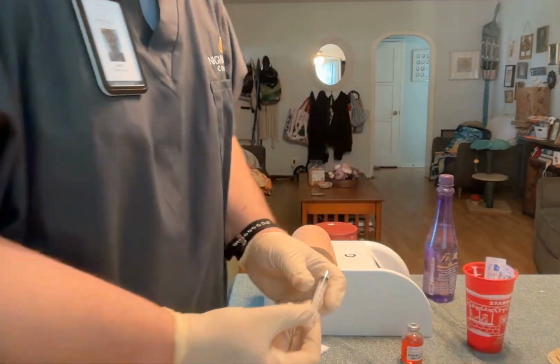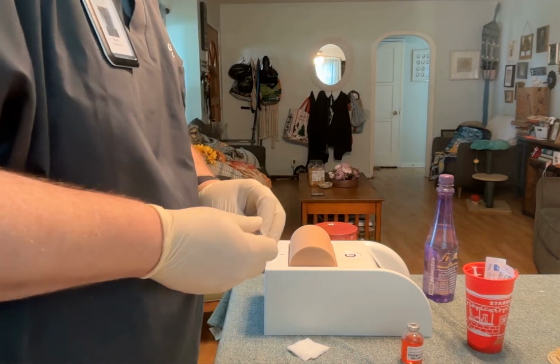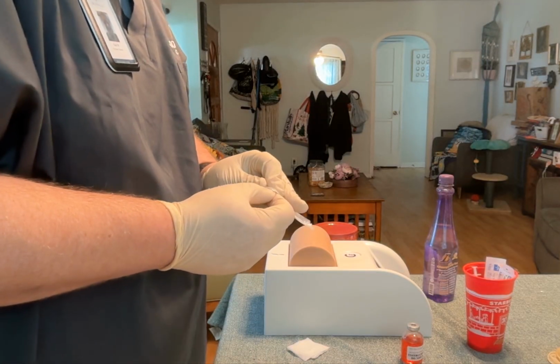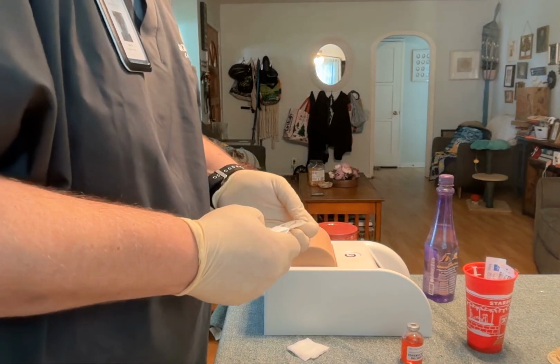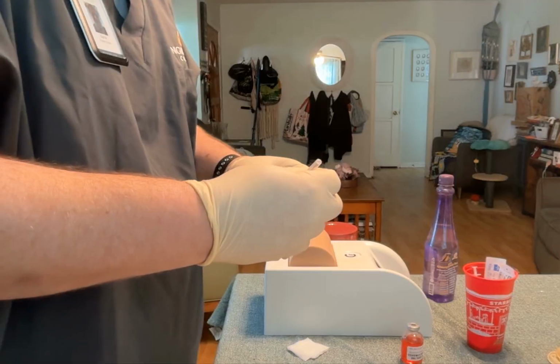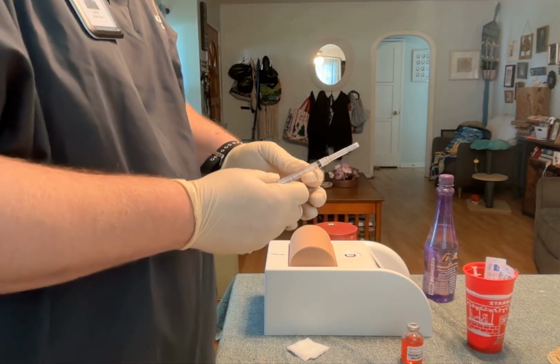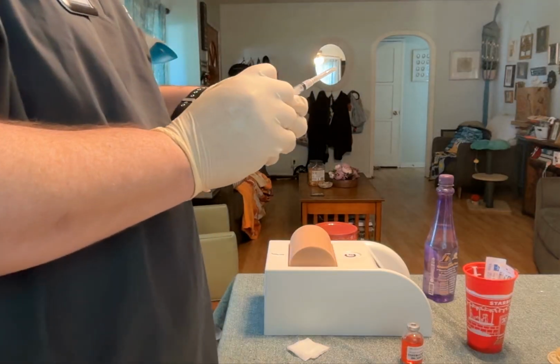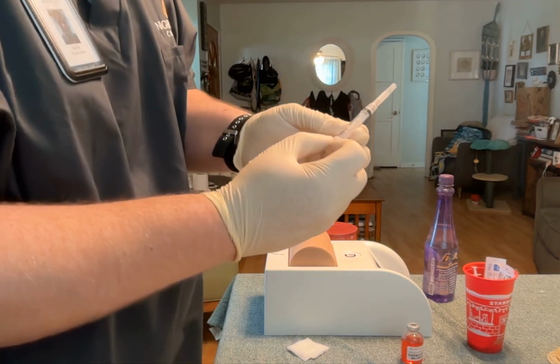I'll remove my syringe, and I've got my needle. And I will attach it to the syringe by screwing it in until it stops. That looks good.